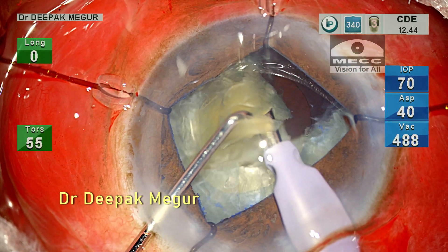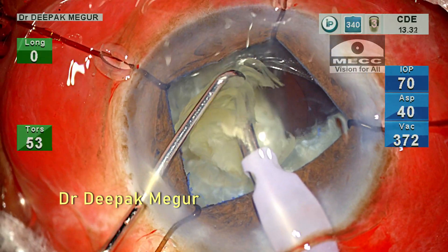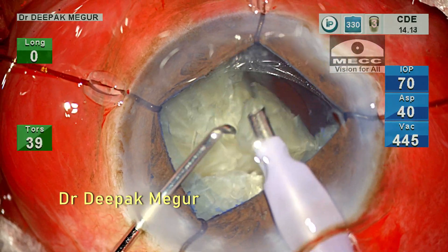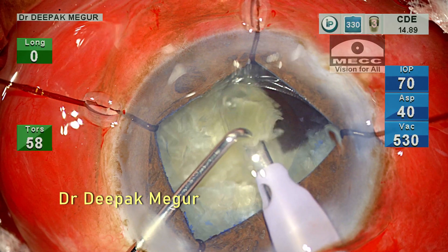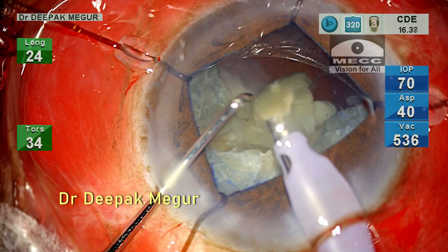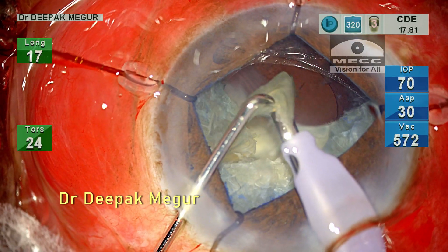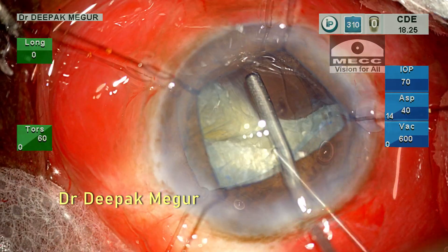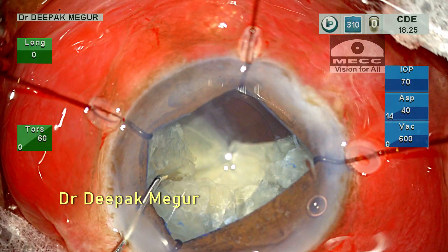Once I have six pieces, I move on to fragment emulsification. Each fragment is emulsified at the iris plane, but the plane of emulsification is more anterior than I would have liked. This is partly because the iris plane has been artificially moved anteriorly by the hooks tenting it up, and secondly I may have been cautious about working more posteriorly toward the loose bag. I use OVD frequently in between emulsifying the fragments to protect the endothelium.